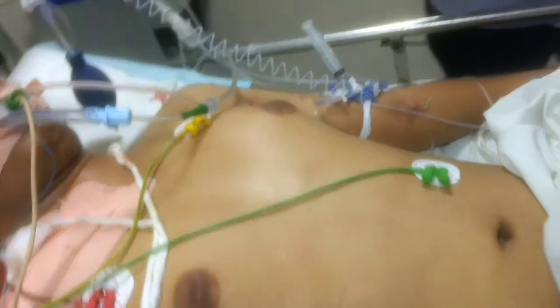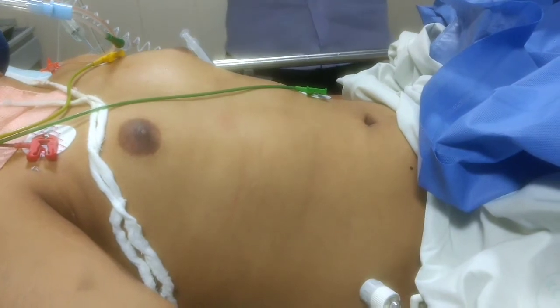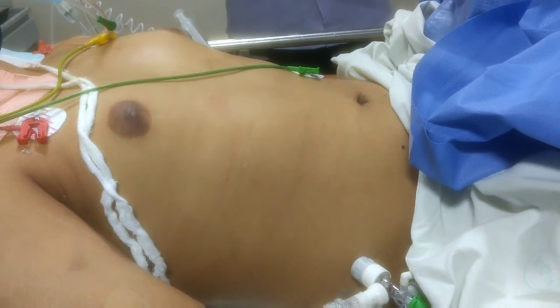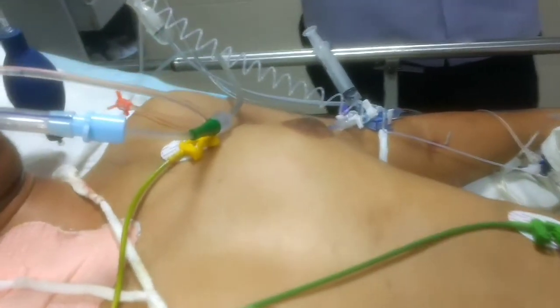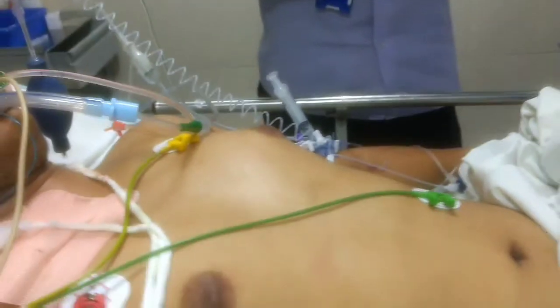Observe for the respiratory movement. You should carefully monitor for any respiratory effort or respiratory movement from the patient. If you find any respiratory movement, just a rise or just a fall, the test will be considered as a negative. Insufflate the oxygen. Carefully monitor the oxygen insufflation devices. Sometimes dislodgement may end up in wrong values.